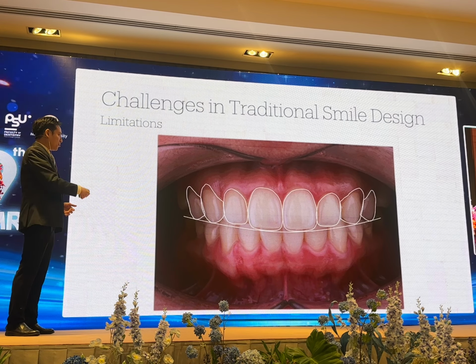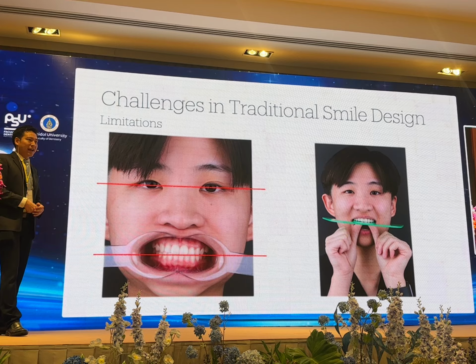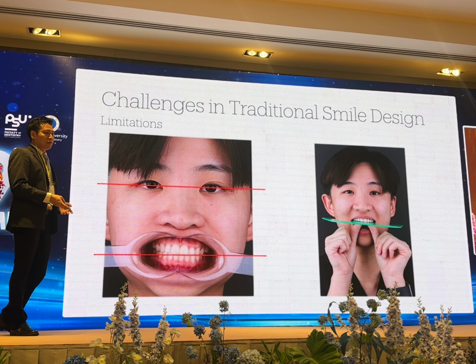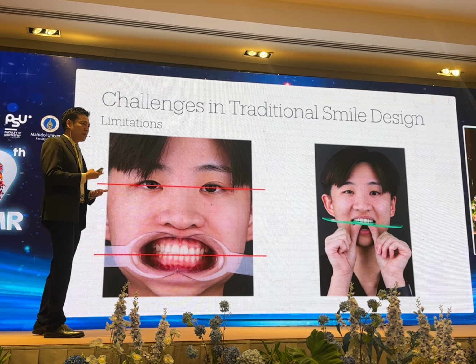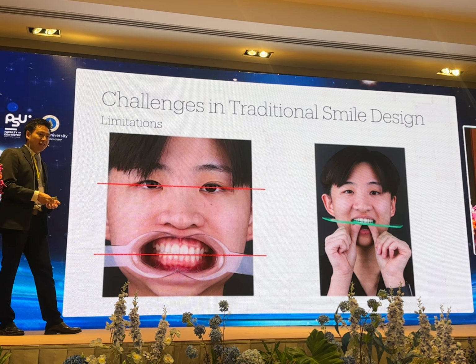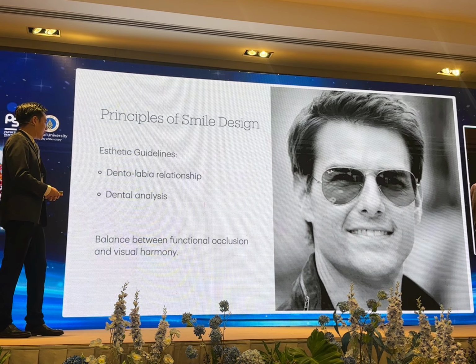However, if you take a closer look at the patient, in fact her occlusal plane is canting. Without the technology, without the digital, without the photography, without the proper examination, it could be very easy for the dentist and for the lab to make a canted restoration for the patient.